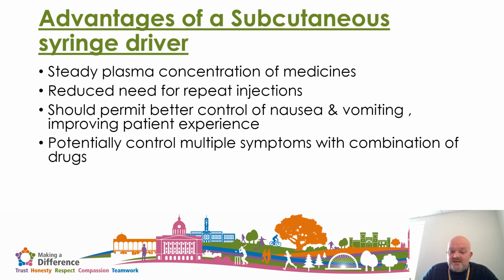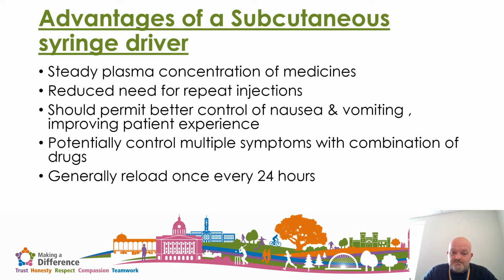So for example, if the patient's got a syringe driver with midazolam, levomepromazine and buscopan, that's going to control restlessness, it's going to control pain, it's going to control nausea, and it's going to control secretions, hopefully. So it's a very good way of controlling a number of different symptoms.